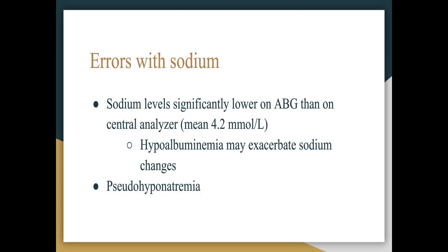There's also the phenomenon of pseudohyponatremia to consider with sodium analysis. Blood gas analyzers use the percent of water compared to non-aqueous components to construct the sodium concentration in a sample. The normal percent of water to non-aqueous component is 93 to 7%. If a patient has hyperlipidemia or hyperproteinemia, as seen with multiple myeloma, this may alter the water to non-aqueous ratio by increasing the non-aqueous component. This will artifactually decrease the sodium on your analyzer, since they are still using the 93 to 7% comparison.